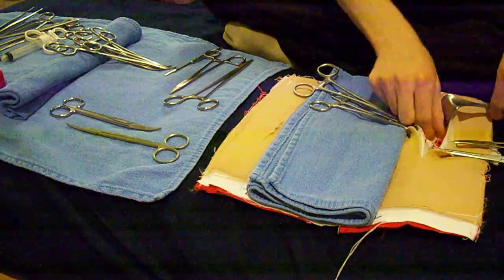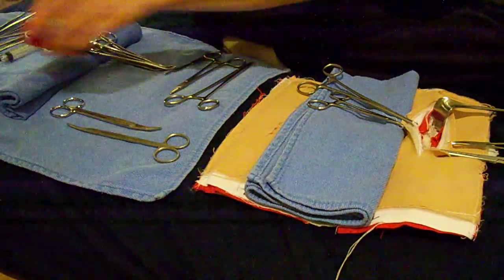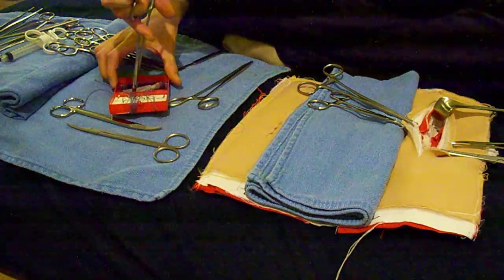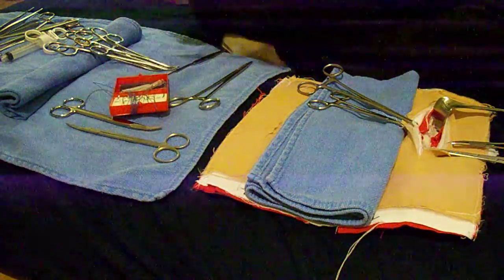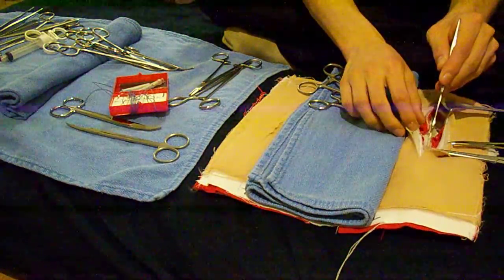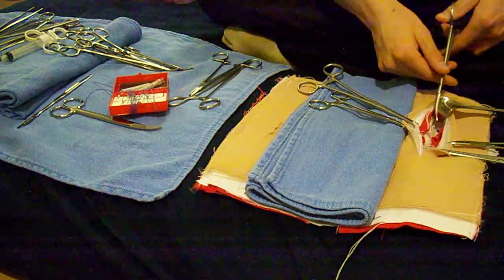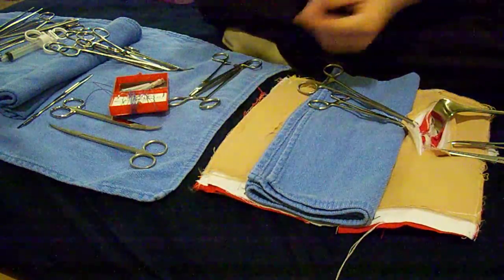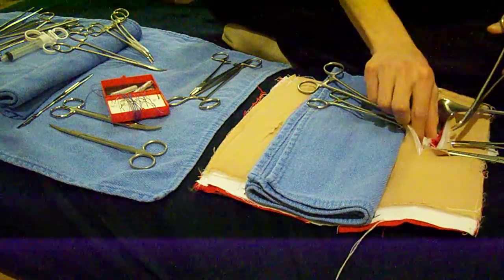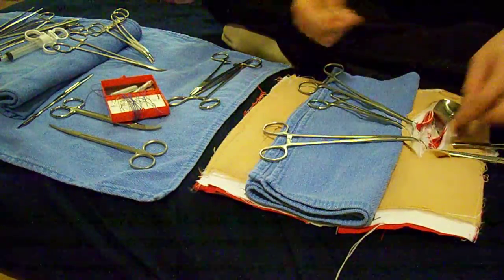Once we get down to the last layer, we reach the peritoneum. We use a number seven handle with a fifteen blade to nick the peritoneum, then go back to the Mayo stand and use Metzenbaum scissors to continue cutting along the peritoneum. For the peritoneum we use two Schnidt clamps, which are for deeper in and can hold the more delicate layers of the peritoneal tissue. Then we are ready to explore.